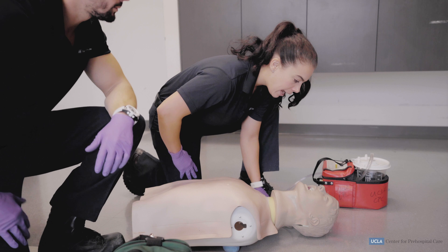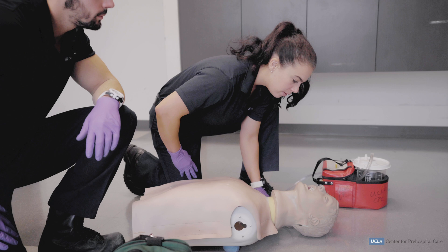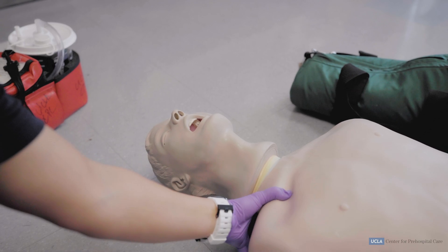Hey sir, are you okay? We need to determine responsiveness using AVPU. Our patient is unresponsive and does not react to painful stimuli. Patient has no response.